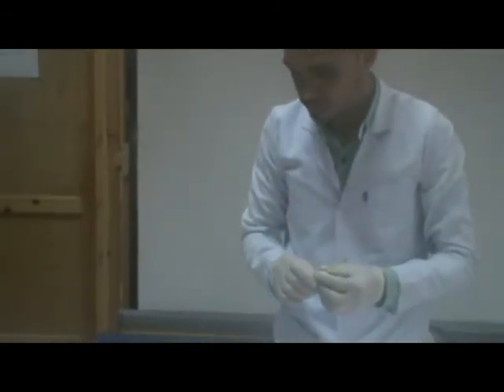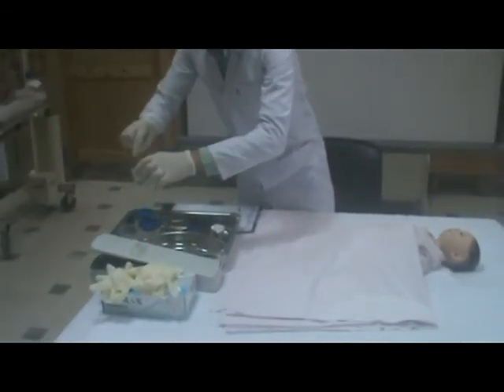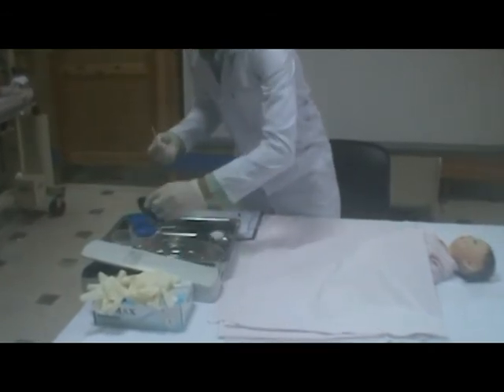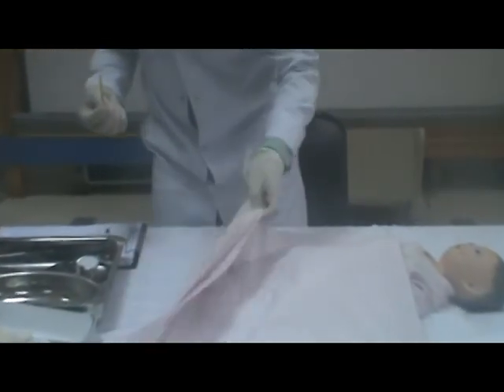Apply lubricant to the thermometer, as lubricant makes it easier to insert the thermometer. Grasp the infant's ankle firmly, placing your index finger between the ankle bones to prevent skin trauma.